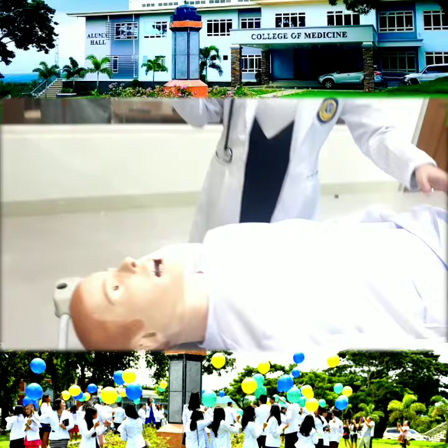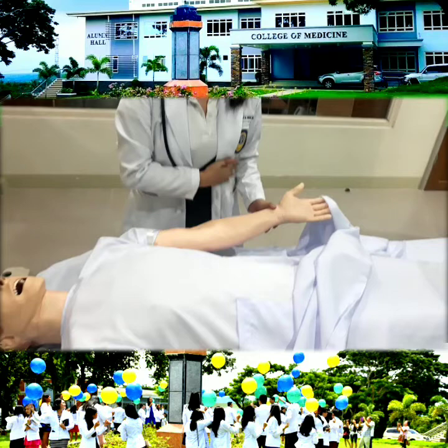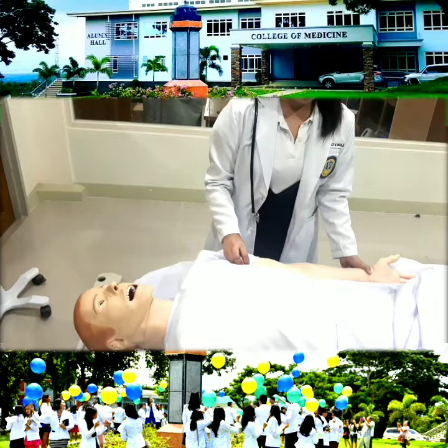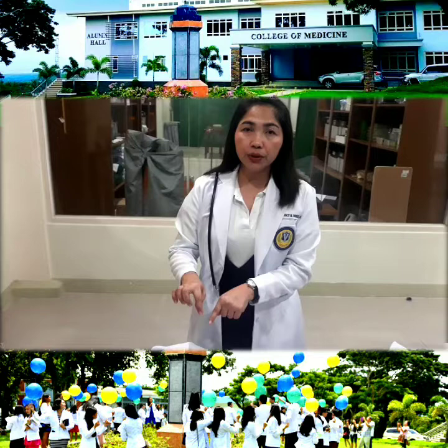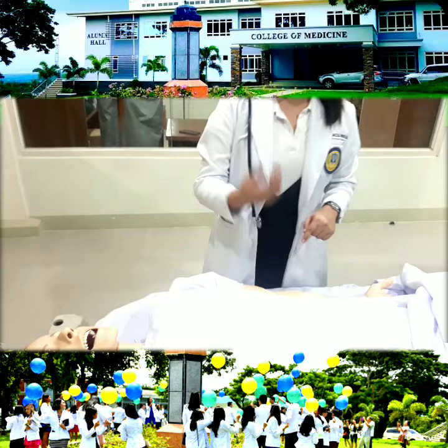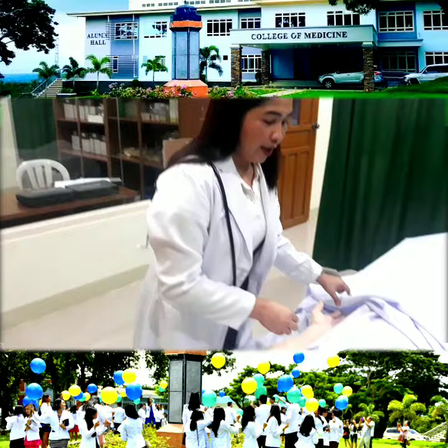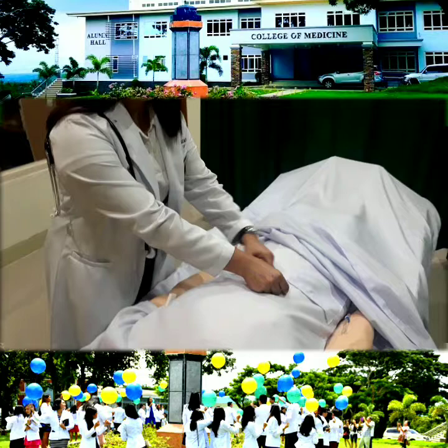Mr. Smith, I will put the thermometer now. The arm of the patient should be across the chest. Since we are using a mannequin, we cannot just put his arms, but it should be across his chest. Why? Because after putting the thermometer on, we have to count his pulse rate and respiration rate. So we put this on first, and it should be followed by counting the patient's respiratory rate. If the arm of the patient is across his chest, we count it there.